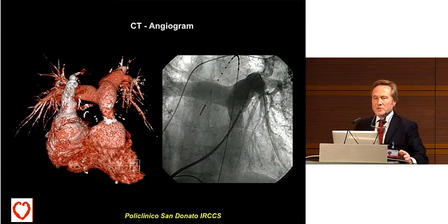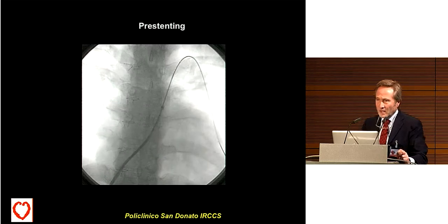In some cases where MRI is not feasible, the CT scan can also be used, as seen in the example with a 3D reconstruction of the CT and the angiogram done in the cath lab.